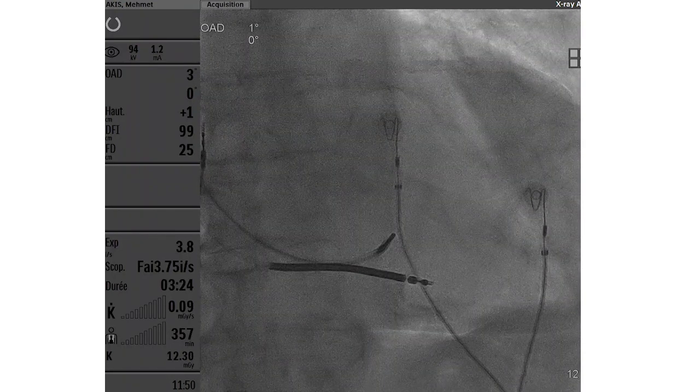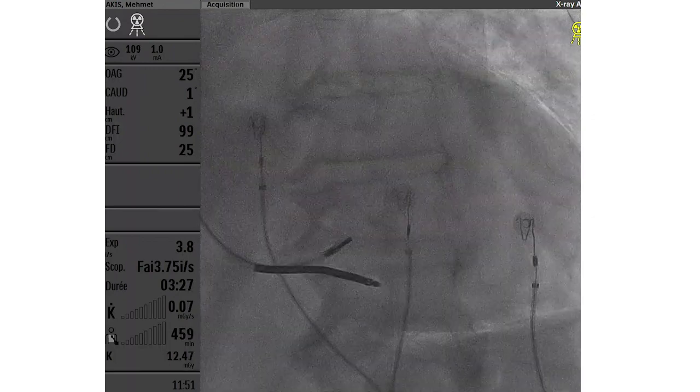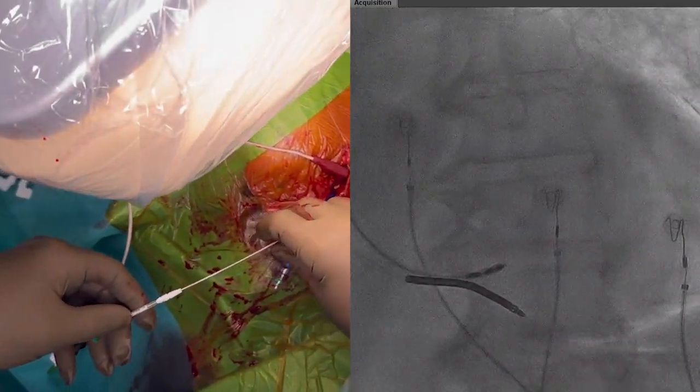This patient, previously implanted with a dual chamber ICD, needed resynchronization therapy because of permanent RV pacing. We can see that the guiding catheter is positioned against the septum in perpendicular fashion, in LAO view.